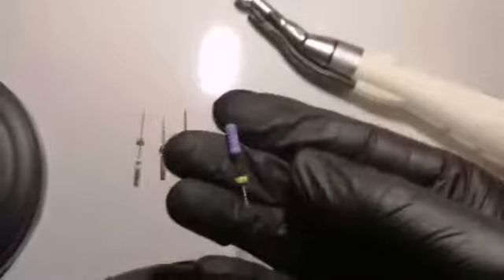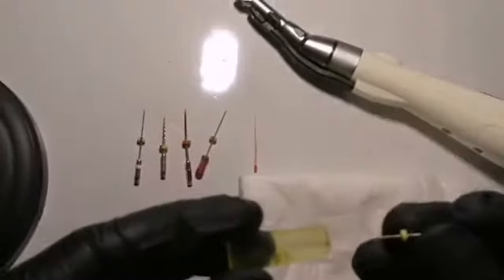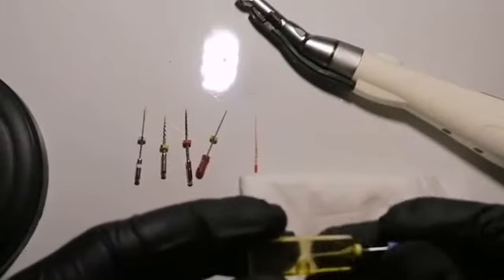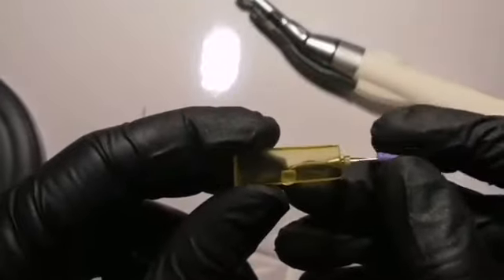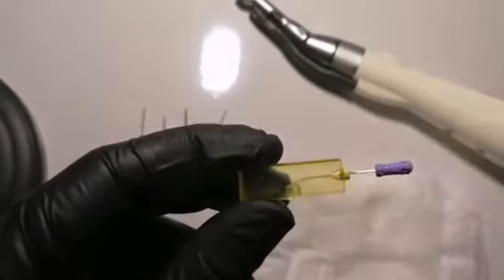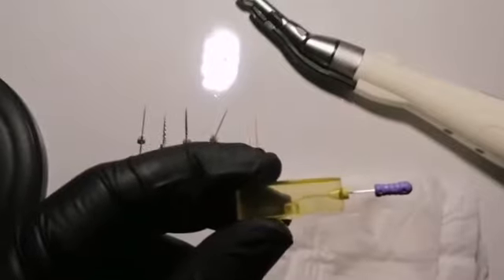Then using the 10k file, which is the stainless steel file, to negotiate the canal, to find the natural pathway of the canal, and to determine the initial working length, which we have previously determined to be 15 millimeters.